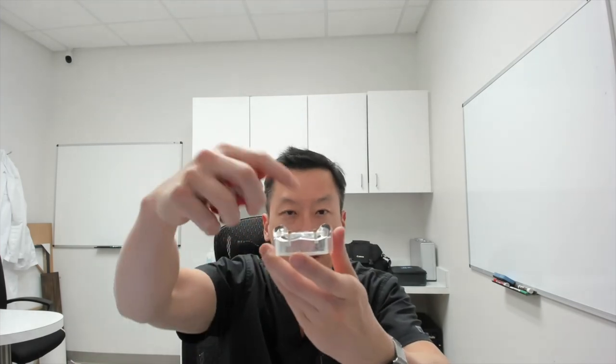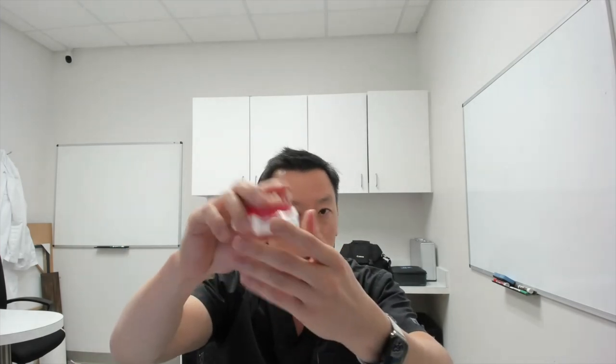I have another example of a snap-on denture here. We have two dental implants here, but basically you see that these dental implants are very parallel, which allows me to use whatever insert that I want.